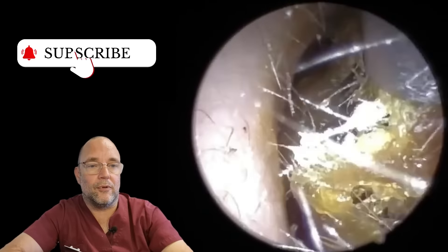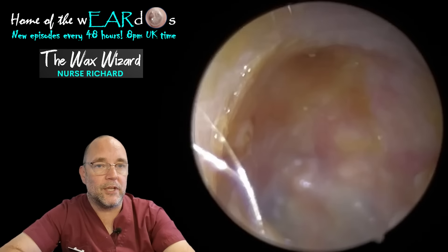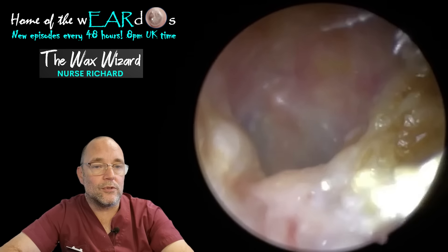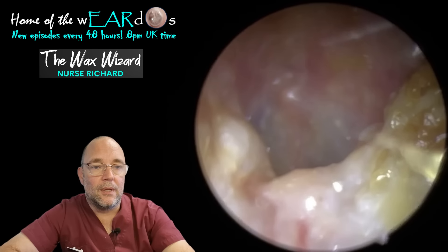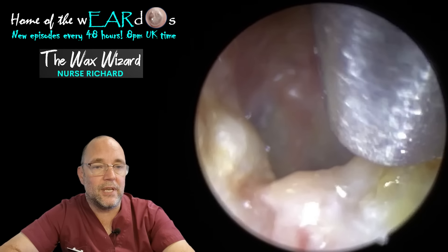Just have a look at the size of this thing as well when it came out. It was massive, but it's just covered by this slimy, white, soggy skin. If any of you have seen a lot of these videos before, you'll know that it always pays to be curious when you can see some white, soggy skin - you can still see some remnants in here. And you're thinking, what's underneath that could be an issue, as there was, as you've already seen.